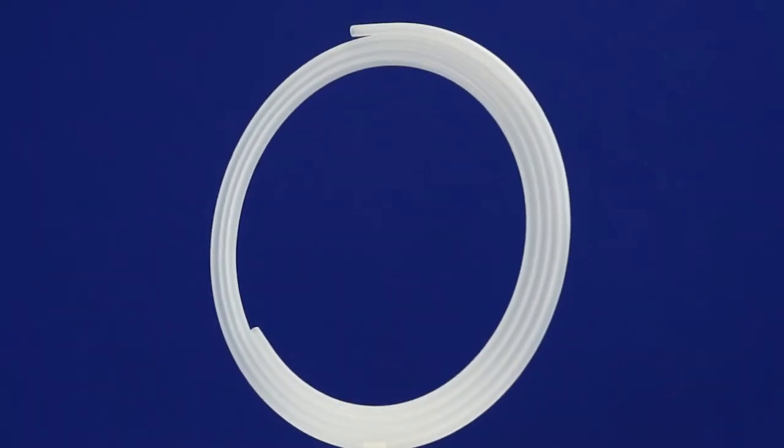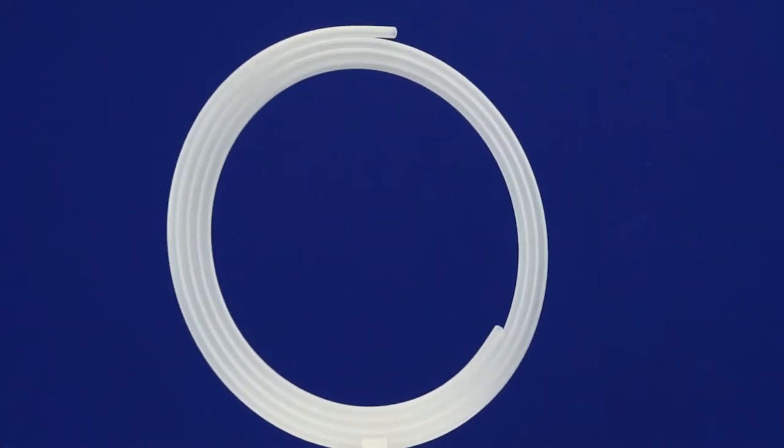Clean Cut Technologies' clipless dispenser for catheters and guide wires represents one of the most efficient catheter packaging systems available for the medical device industry today. We have completely eliminated the clips that common catheter dispensers use.